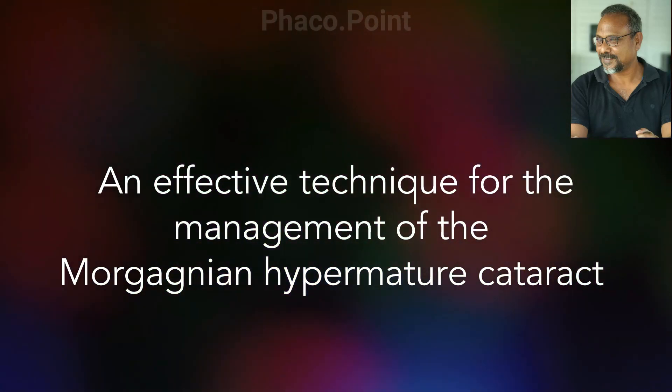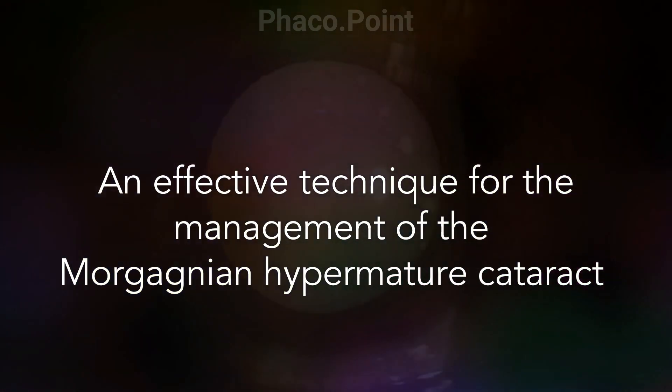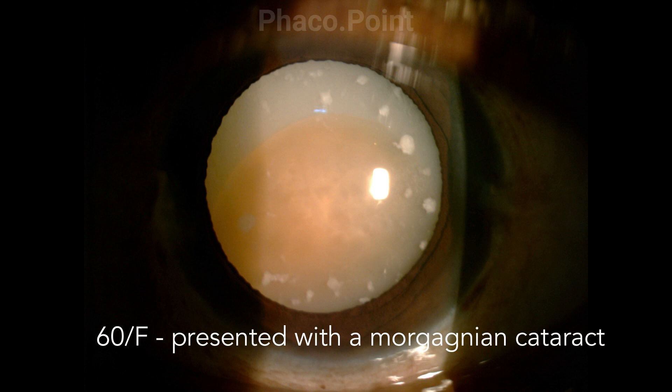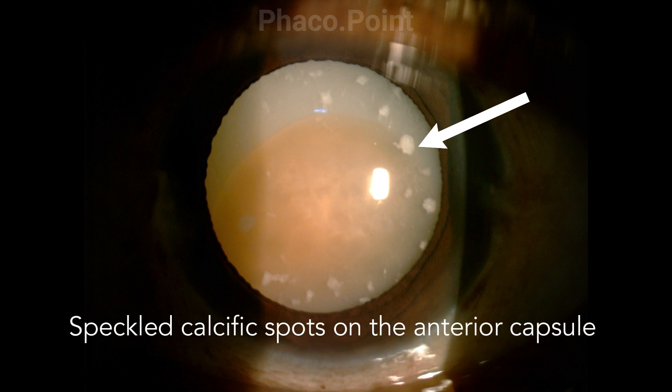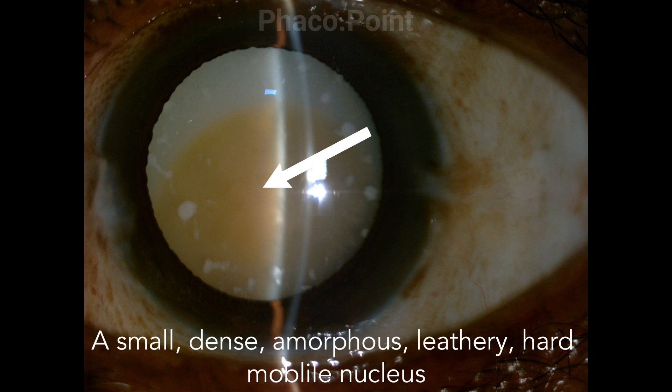My dear friends, today I'd like to describe a very effective technique in the management of Morgagnian cataracts. This is a 60-year-old female patient who presented with a Morgagnian cataract. She had speckled calcific spots on the anterior capsule, a liquefied cortex, and a small dense amorphous leathery mobile nucleus.